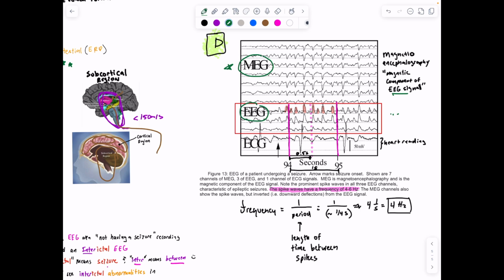Why would they need to give us that information? I guess just to let us know that it exists, but we don't care about that. EEG is what we care about. We're going to look at it in just a second. We also have an ECG here, which is the electrocardiogram, all right? Why would they put this on this graph? If we're trying to learn about EEGs, this is a heart reading, right? Okay, and then you're just like, okay, we care about spikes, and it's like, well, here's a huge spike. That is your heart beating spike, right? Do not be concerned with this, okay, at this moment.